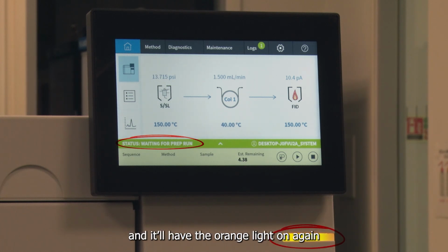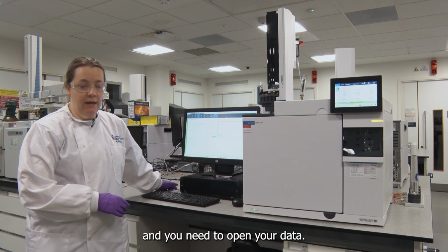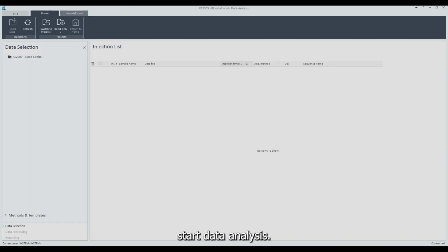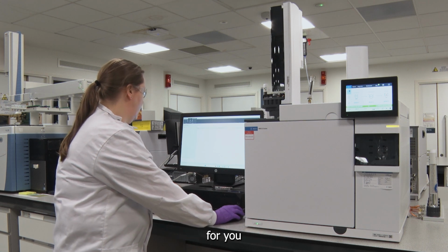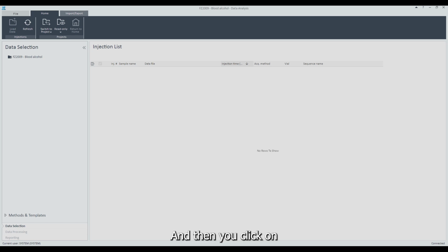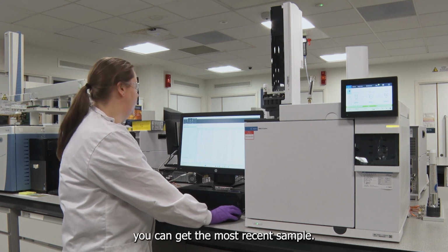So when your sample is run on the GC, it'll say waiting for prep run and it'll have the orange light on again, and the screen will either have idle or not ready on single sample analysis, and you need to open your data. So to do that, you go to Start Data Analysis if the program is open, or you go to Data Analysis, and then you click on Blood Alcohol. This will bring up all of the samples run on this method, and if you order it by injection time, you can get the most recent sample.